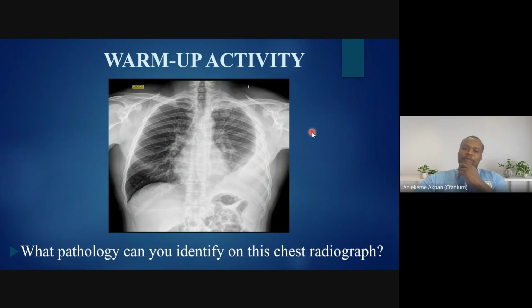However, it is important to understand that what we are doing here is not enough for you to go to work on Monday and tell your radiologist not to resume anymore, that you have taken charge. What we are doing here is to enable us to identify some patterns and then call for emergency when there is one. Because it could be a life-threatening exam, and then you just move around because the radiologist is not on duty, and then something bad happens to the patient, just because you don't even understand the images you're taking.